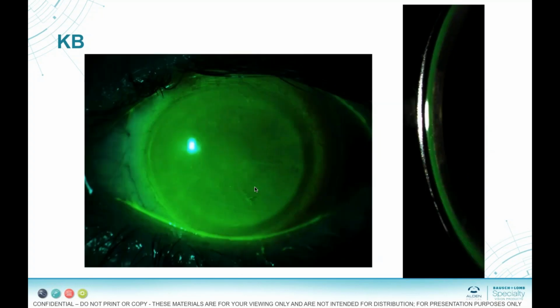And here again, you can see a picture of the fit. You can see the things we're looking for in a scleral lens fit. On the left, you see the overview of the entire eye. You can see a general diffuse fluorescein pattern that looks pretty even and symmetric over the entire cornea. You see fluorescein that extends beyond the borders of the cornea out to the limbus and a little beyond. And then you see also that the edges look like they're laying properly against the sclera. And so this looks like a generally good fit.